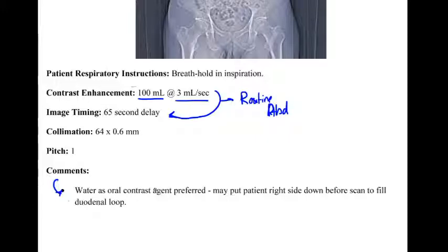The reason we don't typically want oral contrast utilized here is because that oral contrast has a tendency and a propensity to actually cause streak artifacts if it's done in a higher density than what is actually needed. And so you definitely don't want to obscure data or obscure pathology by utilizing oral contrast. So typically it's better to err on the side of caution and only utilize water because of the decrease in the amount.